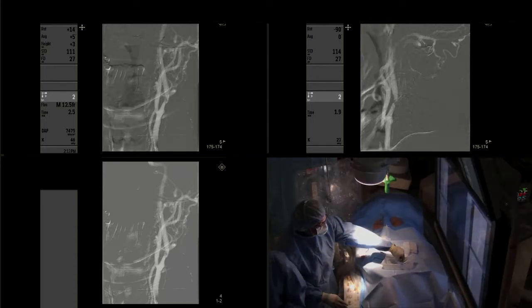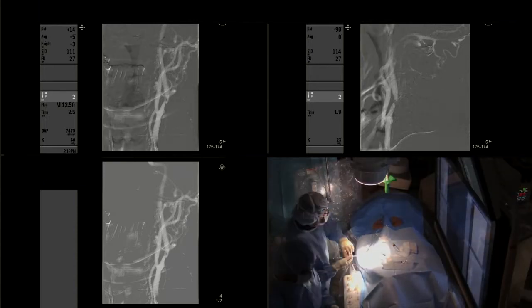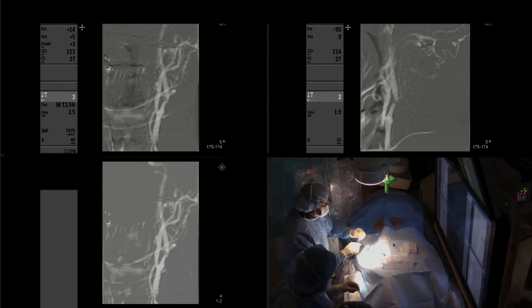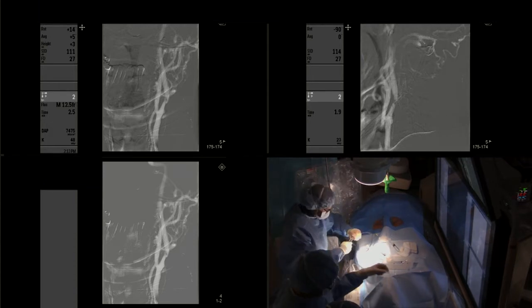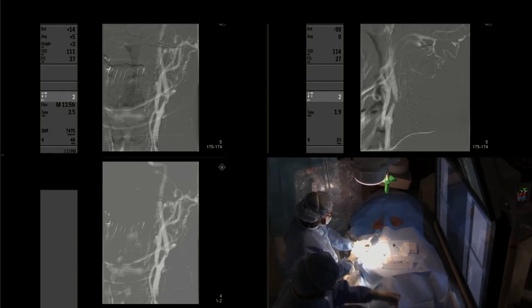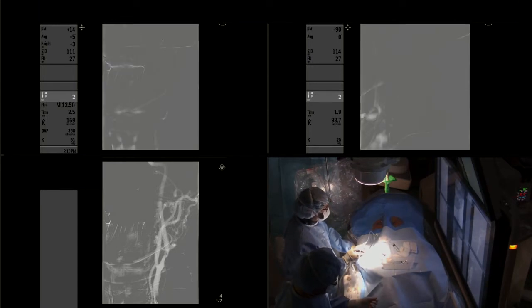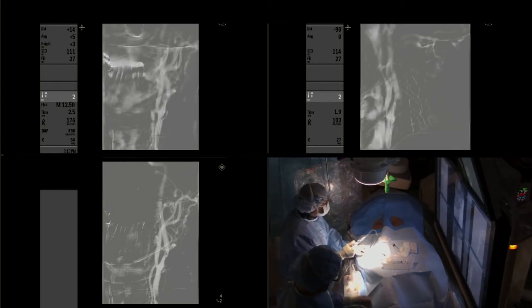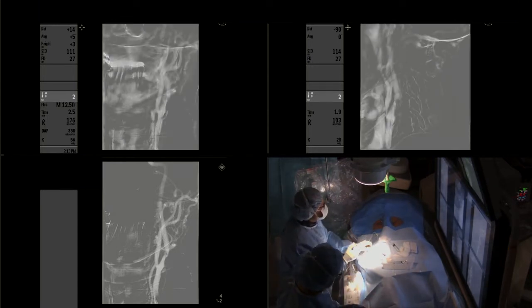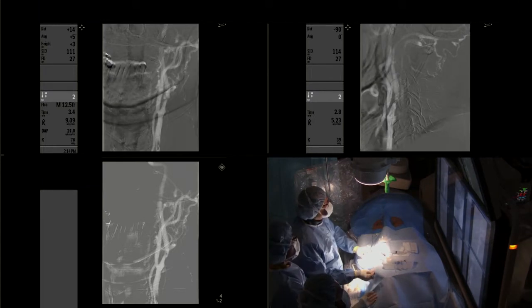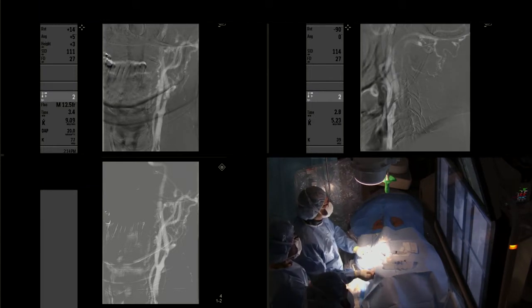After the device is in place, now we are going to obtain a new road map as we straighten the artery. You can see that because of the wire that we have in place from the distal petrous segment of the ICA to the groin, the artery is a little bit more straight.